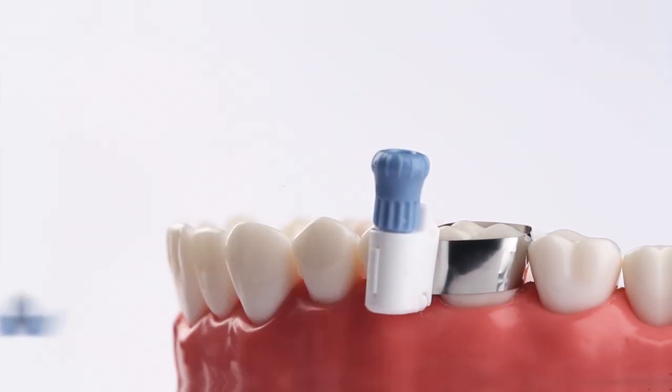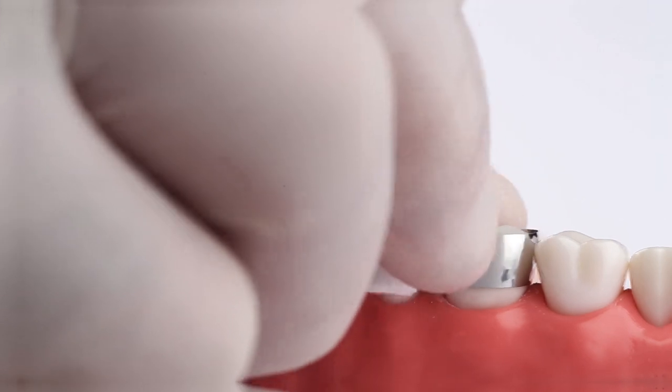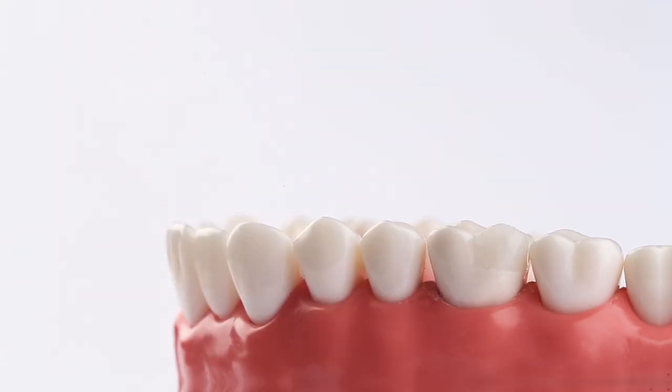Following restorative curing, remove wedges and turn the thumbwheel counterclockwise until the matrix is loose. Get less flash and an efficient procedure.